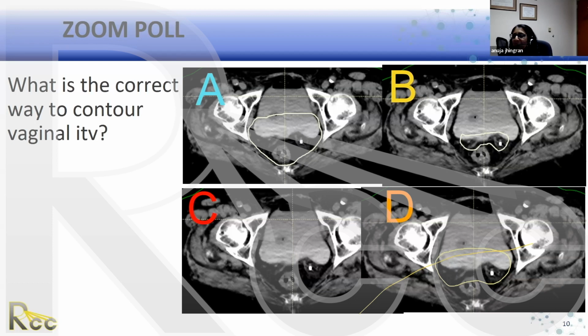I thought we'd do questions first and then go to contouring, because I think the questions are actually bringing out all the issues of contouring in the first place. You can watch me contour all you want, but I think this really answers your questions more than anything else. This could be either cervix or endometrial, but I can make it cervix and that would maybe make it easier. This is all post-op.